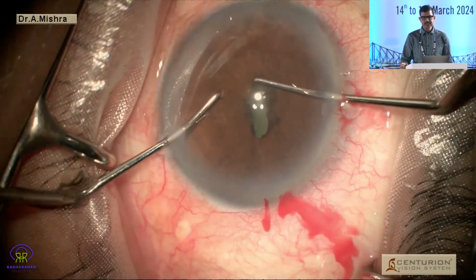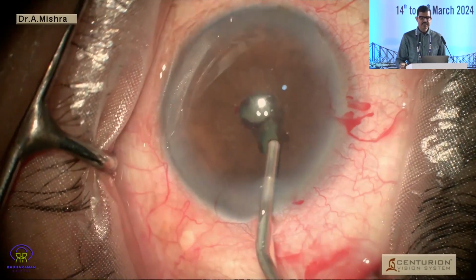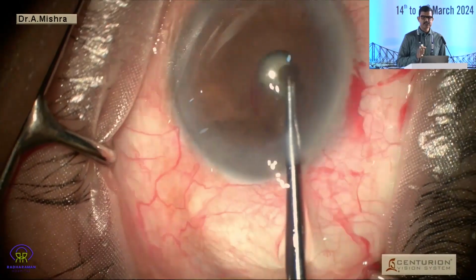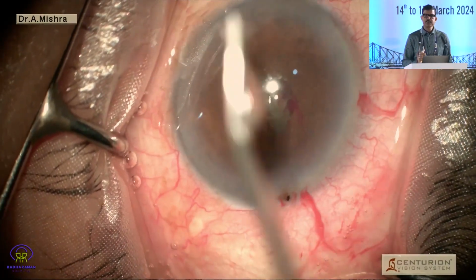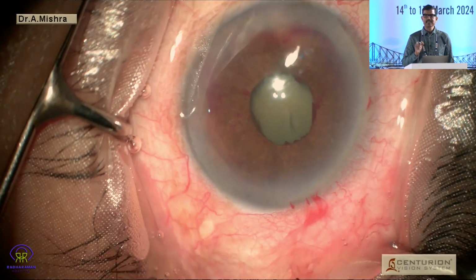So a hole needs to be punched first, and then with the Simcoe, it was extended. The moment the cyclitic membrane is peeled off successfully, you will have a little bit of bleeding from the pupillary margin. That, in fact, is an indicator that the pupillary membrane has been effectively removed. At times, removing these membranes just restores its geometry. It becomes more circular so that you can implant the devices.